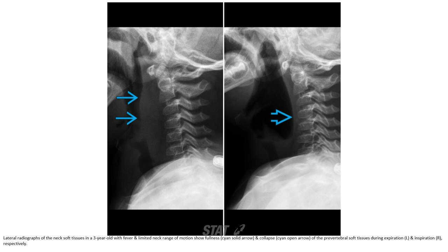The lateral airway radiograph of the prevertebral tissue in this case, with fever in the clinic, showing bulging and collapse of the prevertebral tissue during expiration and inspiration.